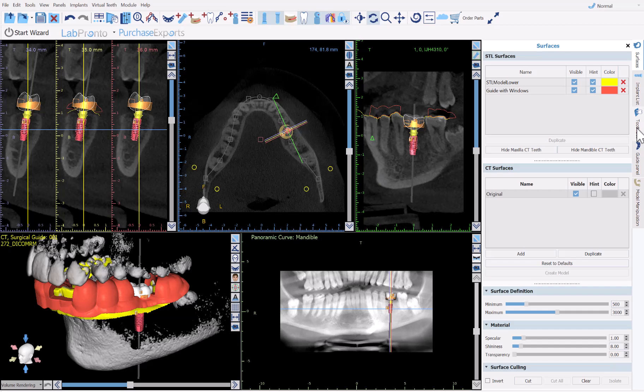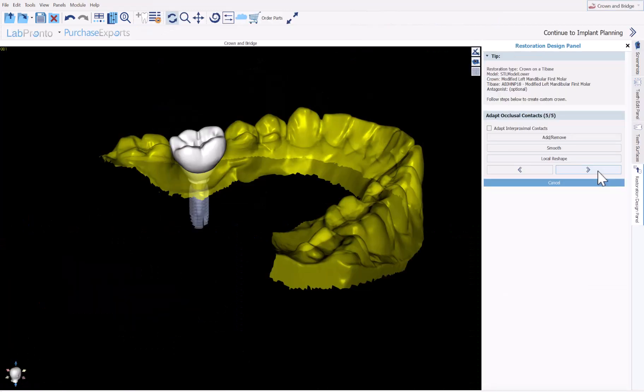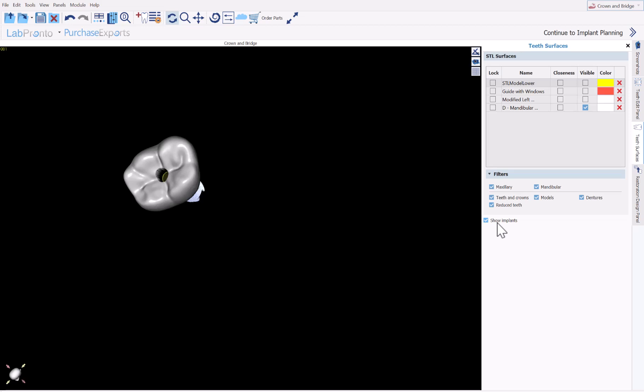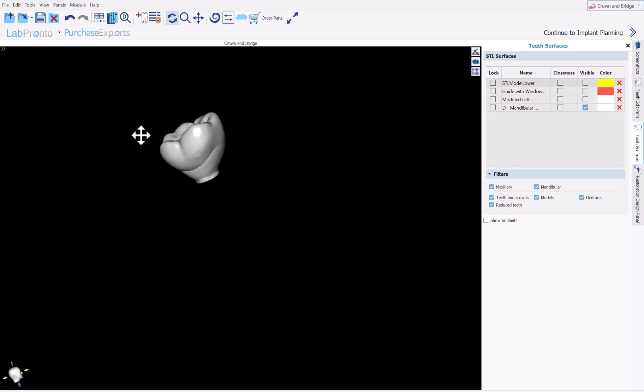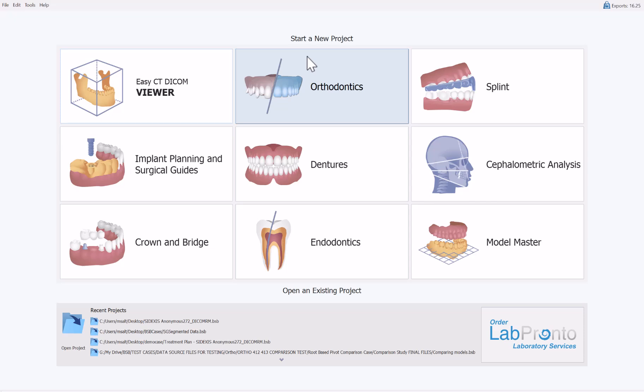Hello everyone, this is Michael from Blue Sky Bio. In this training tutorial I'm going to show you how easy it is to turn an automatically designed tooth — we're going to take a look in version 4.13 of the Blue Sky Plan software — to take the automatically designed tooth treatment plan and create the crown for an immediate load case. The export of the crown from the Blue Sky Plan software is completely free, so you could export the STL file as well as the XML file for the milling machine directly from the software.